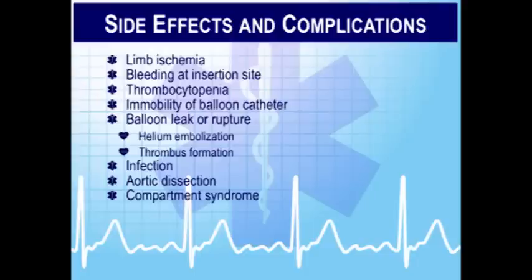Balloon leak or rupture happens, particularly if patients have calcified aortas. And it's not usually something in the first 24 hours that will happen, but 2, 3, 4 days in. And the balloon doesn't rupture like a party balloon. It gets a hole in it and the helium leaks out of it. So it's not like there's pieces of balloon circulating around the patient's body, all right? They've done lots of studies on that.